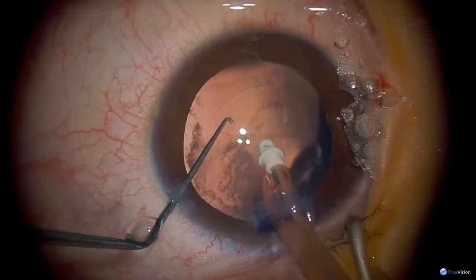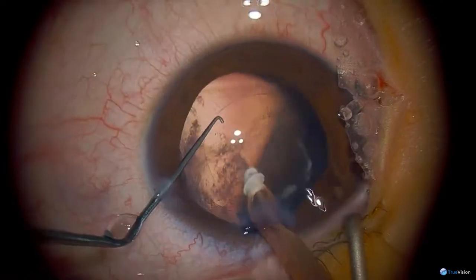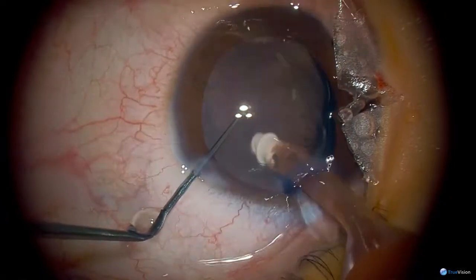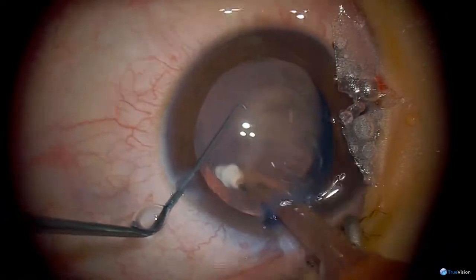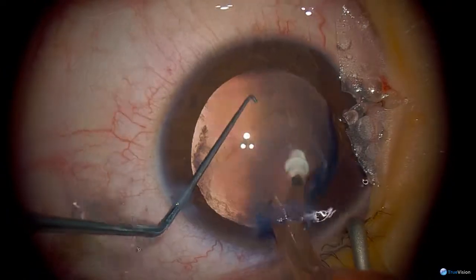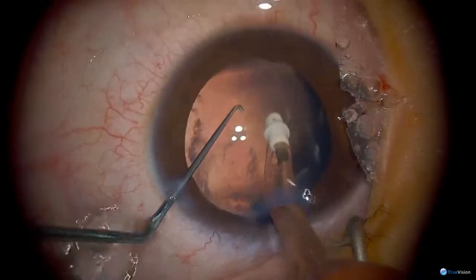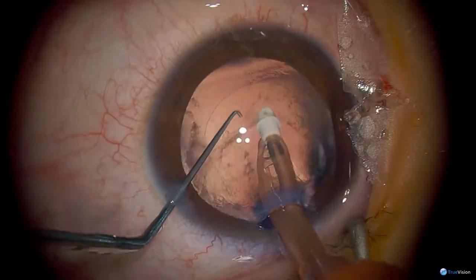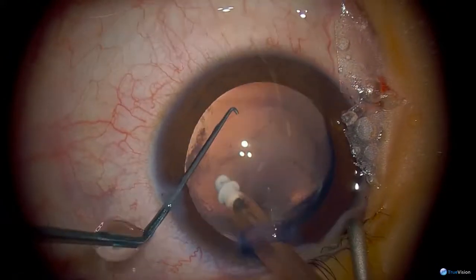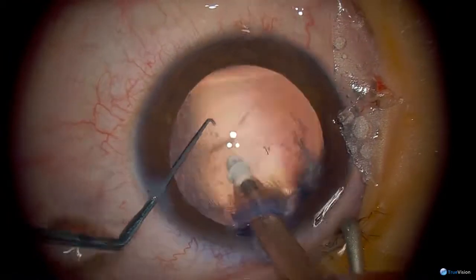I think what I'm going to do is put a lens in the eye now — a 24.5 MA60 AC. That may be the posterior capsule that's broken there, and that may be the anterior hyaloid face that's behind.